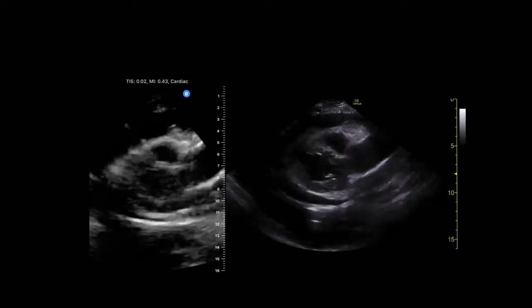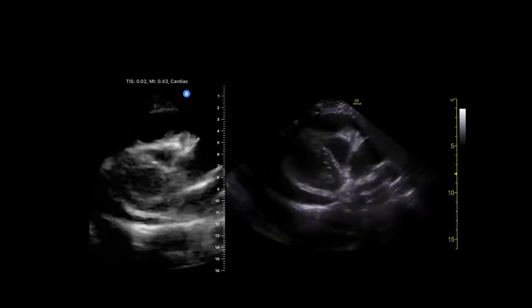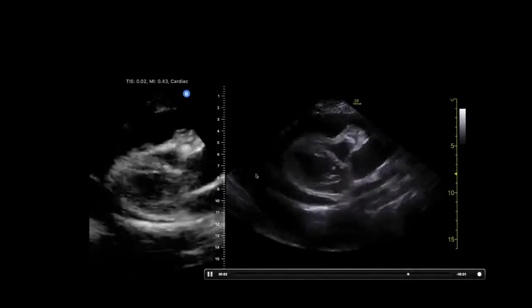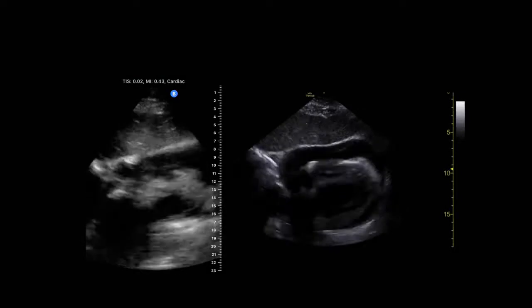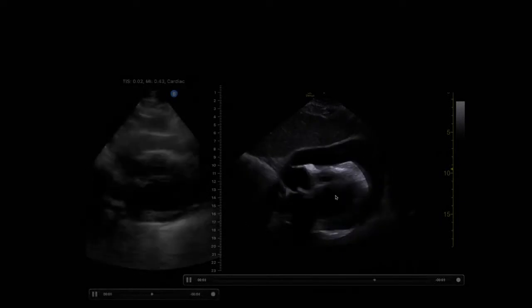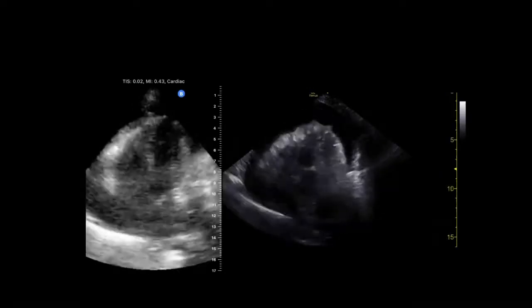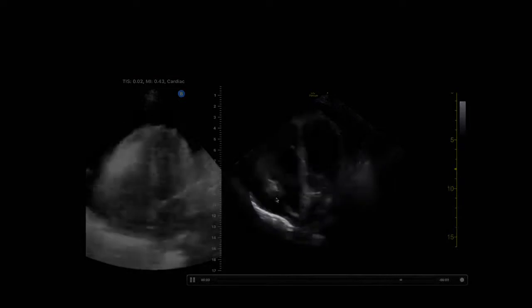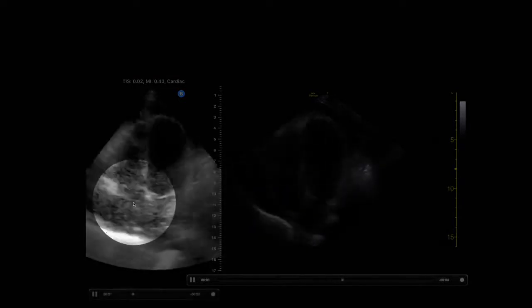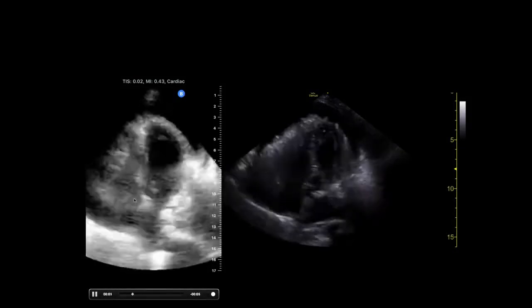But you compare that to the actual base system, and you can definitely see that there's a lot of difference in the image quality, right? You're going to see this is a little more disorganized. Now, here, for the parasternal view, they were excellent, right? But when you look at the subxiphoid view, it might not even be the same thing. You can see the liver way better here. You see everything, you see that right ventricle being contracted and basically collapsed there. And even for the apical four-chamber view, here you can even see a little bit of collapse of the right atrium down here. Well, you can barely see anything in this view, right? So while you are getting the whole picture, you're still missing some stuff, right?